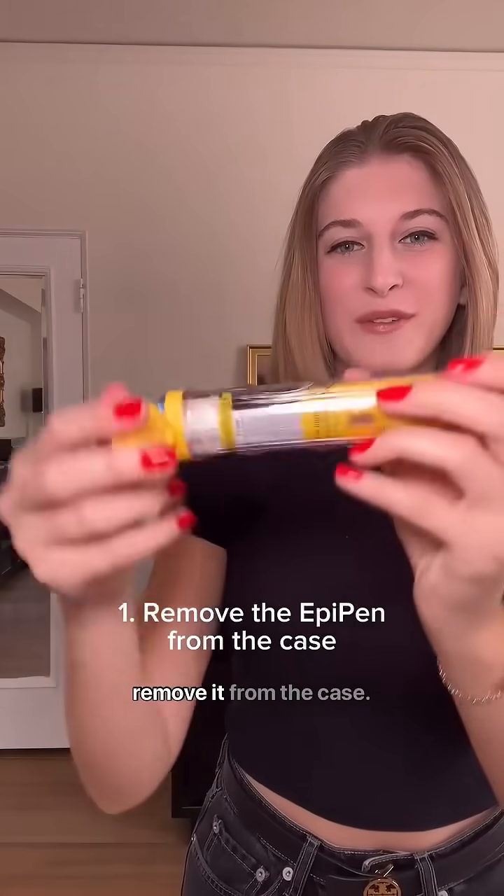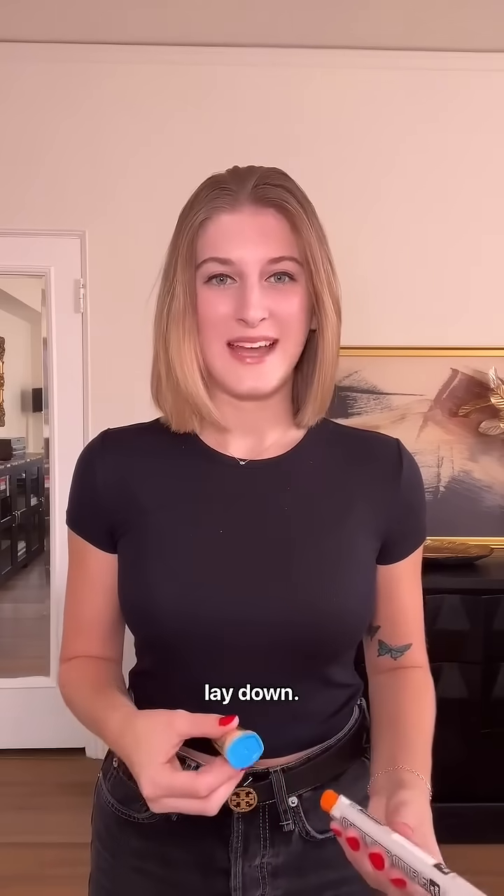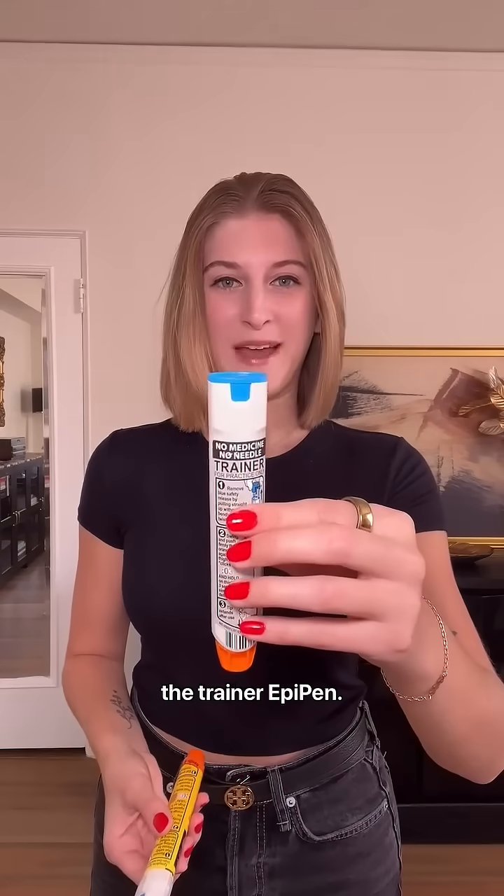Take one of the EpiPens and remove it from the case. The best way to administer an EpiPen is by having the person with a reaction sit or lay down, but I'm going to stand for this demonstration and use the Trainer EpiPen.